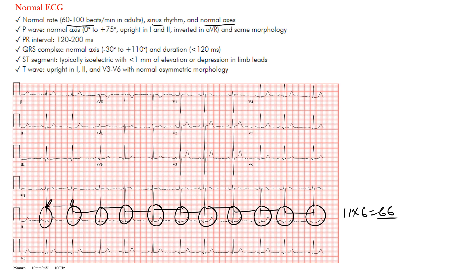Do we have sinus rhythm present? In sinus rhythm you tend to want to see P waves that are upright in the lateral leads. Here's an inferior lead where you can see these upright P waves, same thing in lead one. Over here in the precordial leads you can see P waves showing up as well that are upright, and then you have inverted P waves present in aVR — a little hard to see but they're present. So this is certainly sinus rhythm.